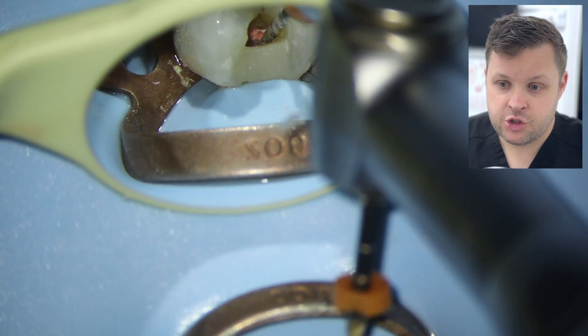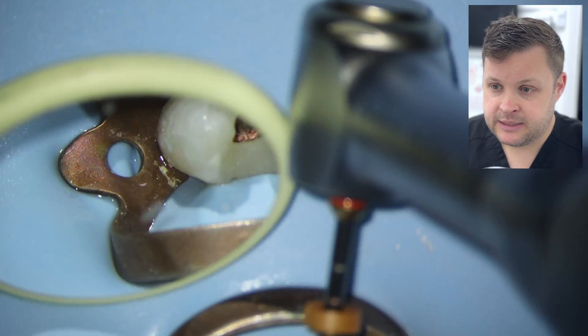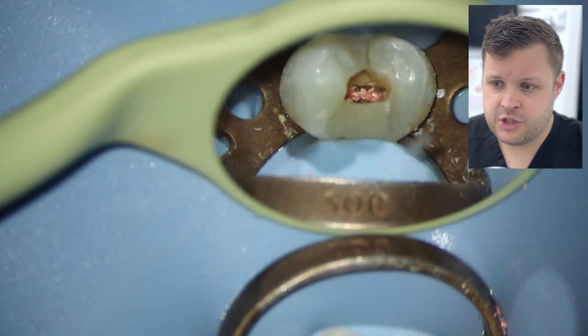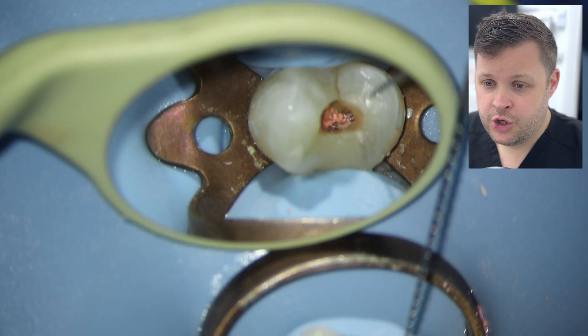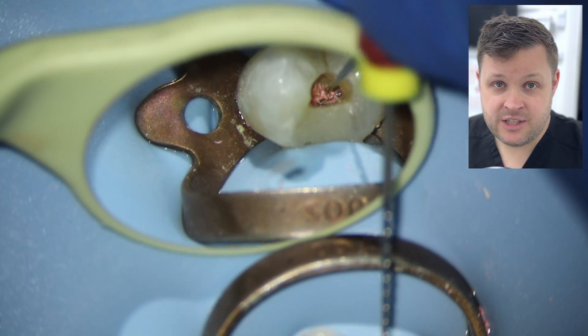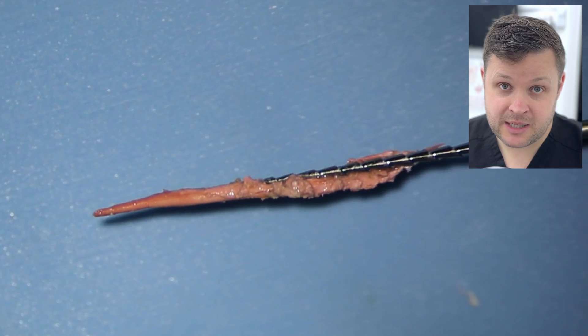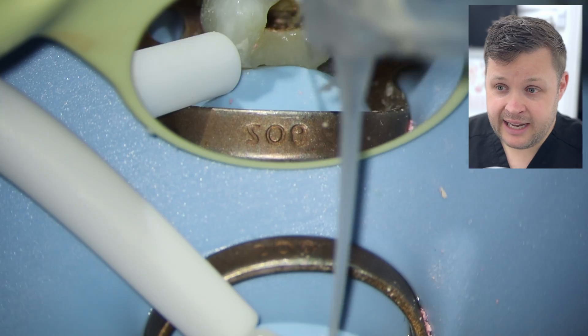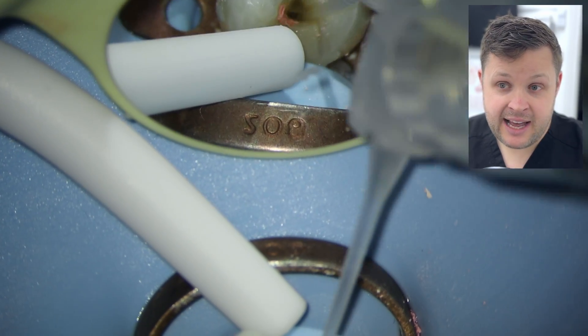Again using the DG probe to dislodge GP from the walls, then straight back in with a HyFlex with lots of irrigation. At this point I can't quite remove all the GP, so I'm going to try the H-file technique — screw the H-file into the GP, warn the patient I'll pull quite firmly, and as I pull the H-file out I've managed to remove all the GP in one piece. That's a super nice feeling — it removes all the big fragments, which can be difficult and time-consuming.